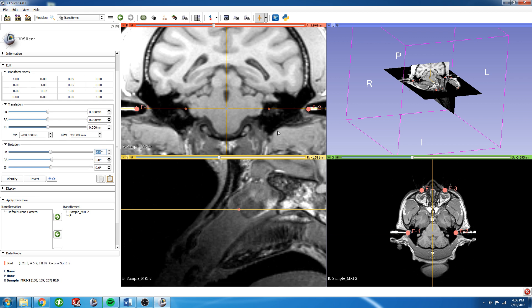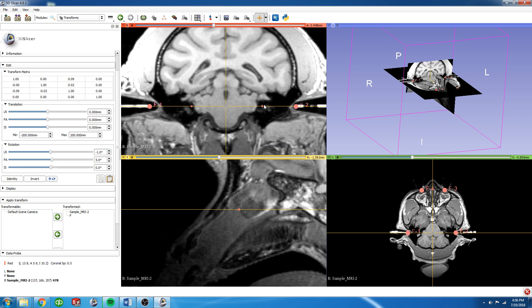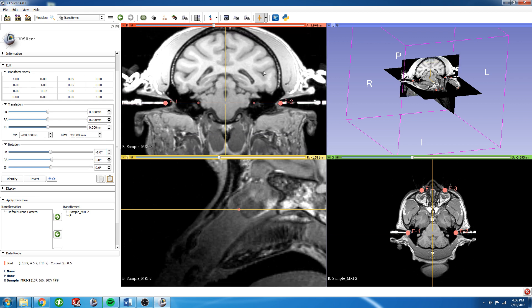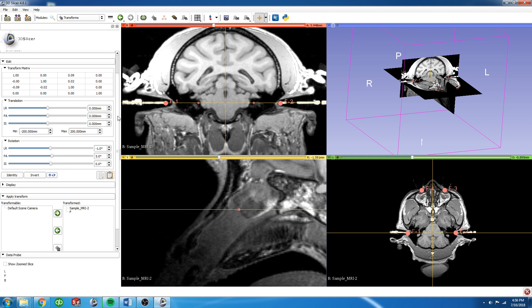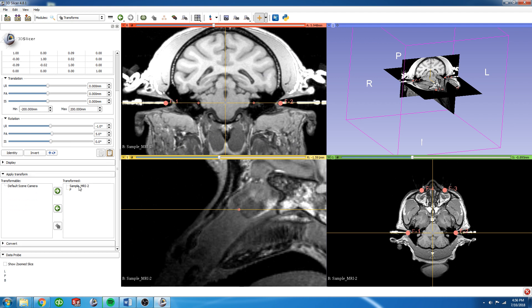So now we're going to call that stereotaxically aligned. From here what we're going to do is go to the MRI as well as the fiducial list and harden them to keep those changes.